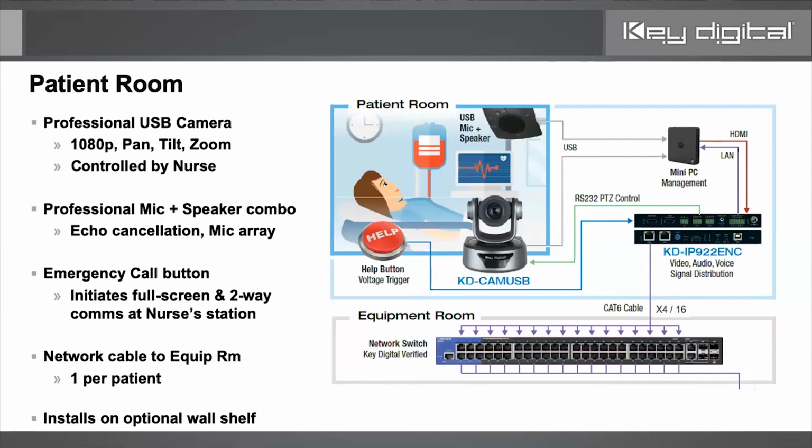If you think about that, that's not traditional. So one of the hidden layers, if you will, or under the table kind of things that is behind the curtain, I should say, is that this system also utilizes our engineers' audio over IP server client software. We get the mini PC on the network, and we're able to take the audio as a client from the patient room to the server, the nurse's station. So that's kind of how we're handling those USB devices.